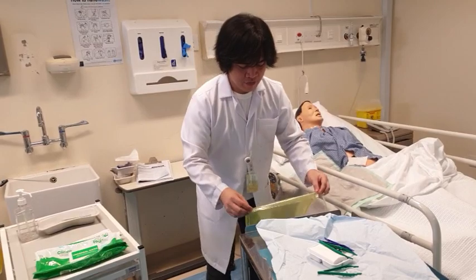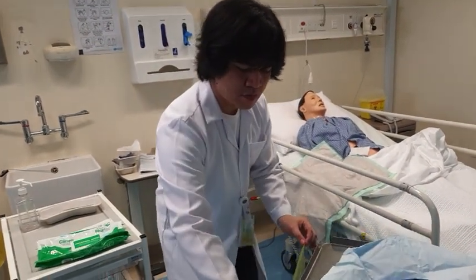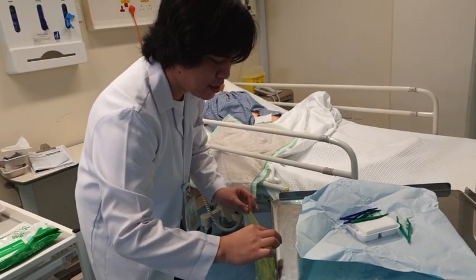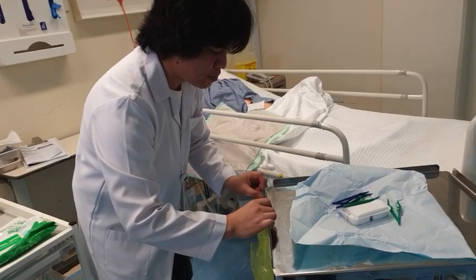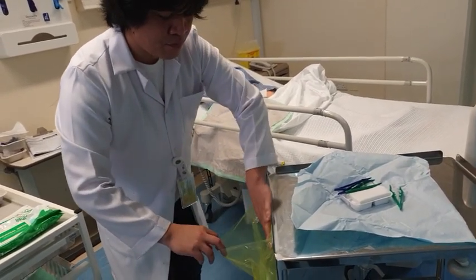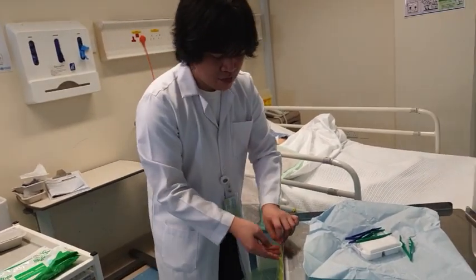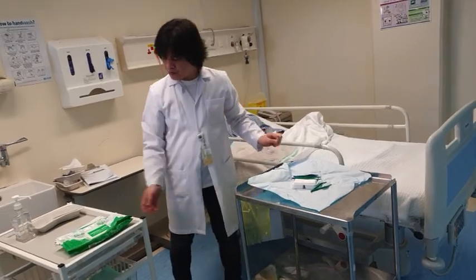And we're going to attach this one in this side. Like this. And make sure that the opening is widely exposed. Okay. What else?